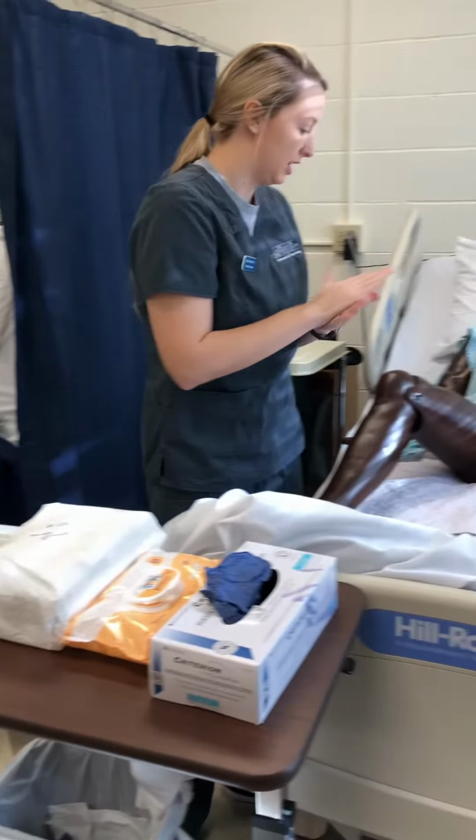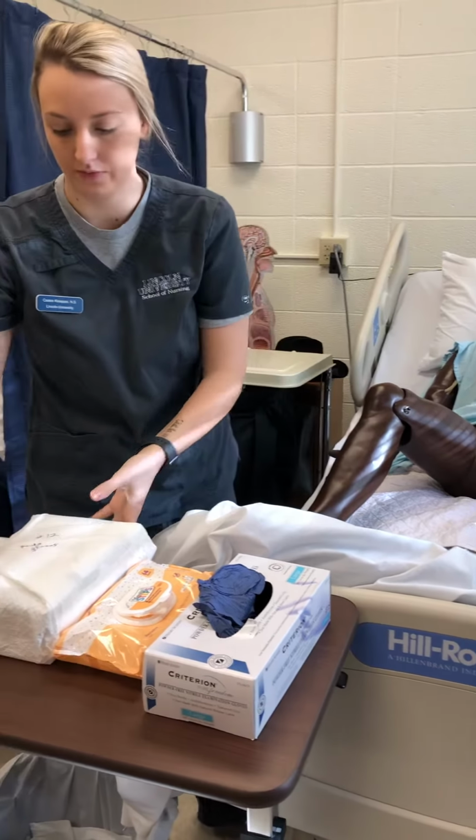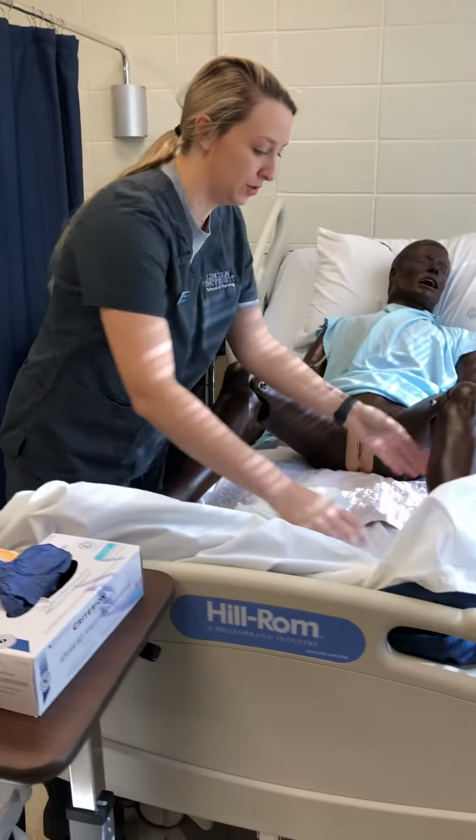Now I'm just going to be setting up my sterile supply in between your legs, so I'm going to have you hold as still as possible while I'm setting this up and throughout the procedure.